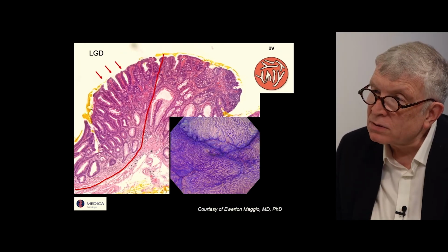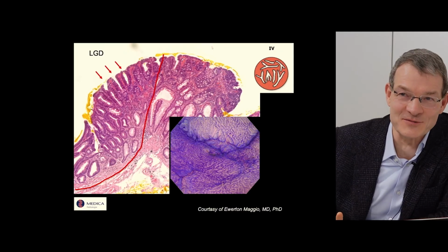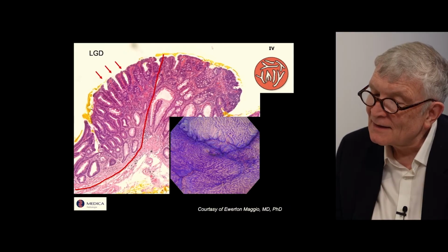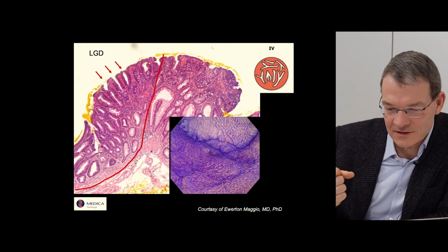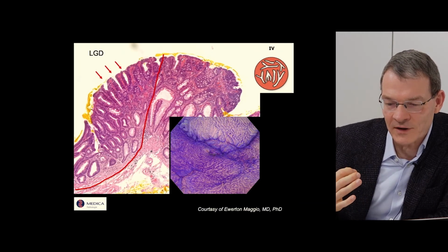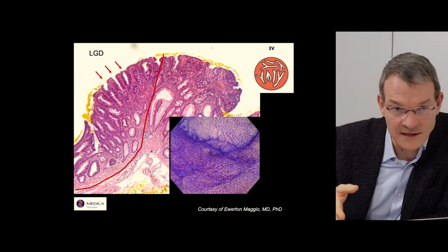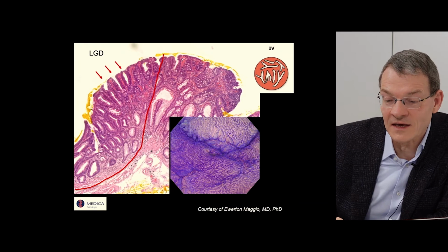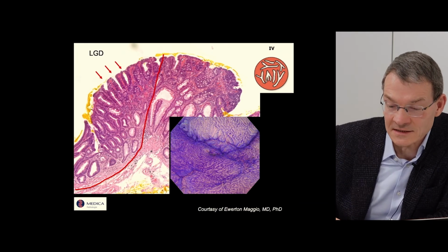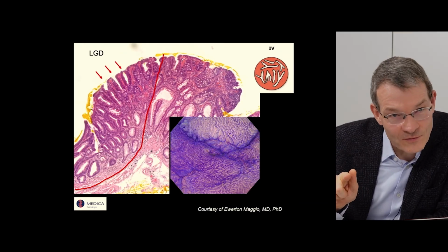Okay, so I know you want to say the consequence anyway, resection, but what I want to show is that we should better focus, and we try to do a proper endoscopic assessment, and we will have more complicated lesions than this lesion, where the decision is more complicated. But I think what I wanted to show is that we can do JNET, but we can also do Kudo.